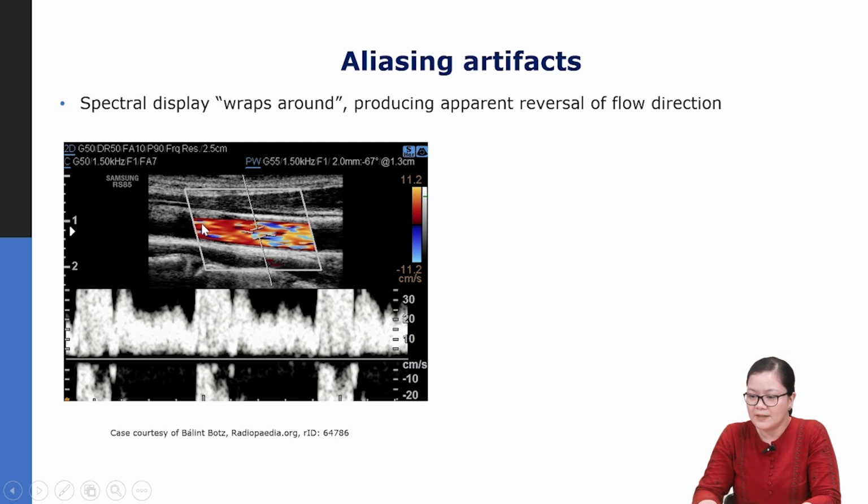And in the color Doppler display, what you can actually see is a mixture of blue and red hue, and in the intermediate parts as well. Typically a healthy vessel would have either a red or a blue hue depending on the direction of flow. If you find a region where there's a mixture of red and blue hue, that means there's some turbulence in there, or it's because of some inconsistent PRF or very low PRF due to this aliasing artifact.